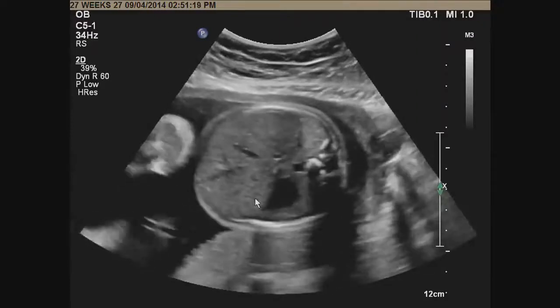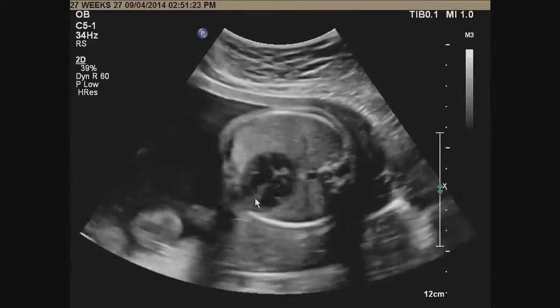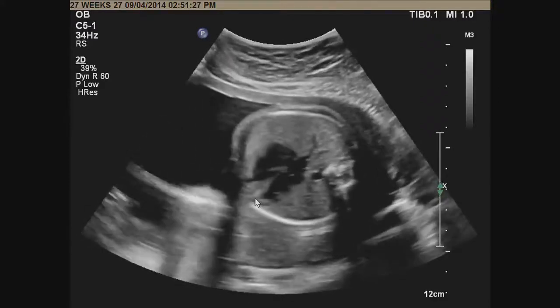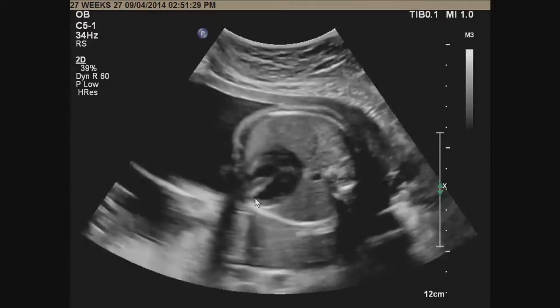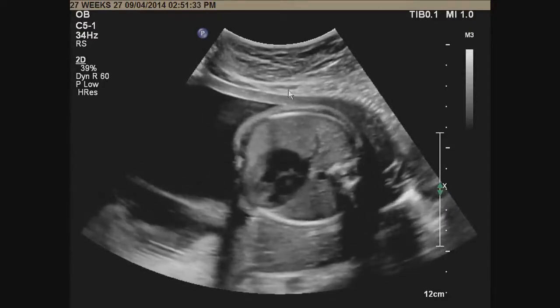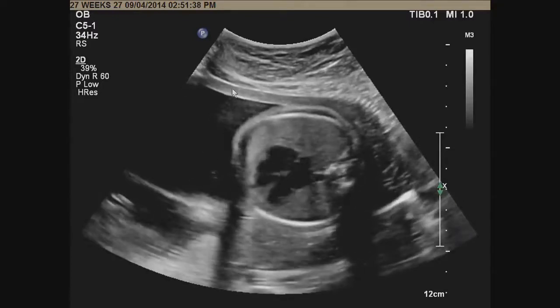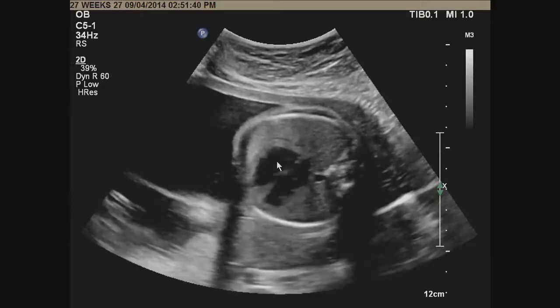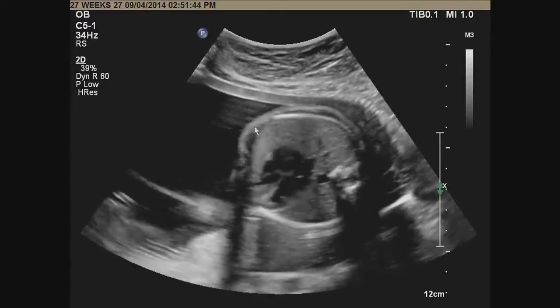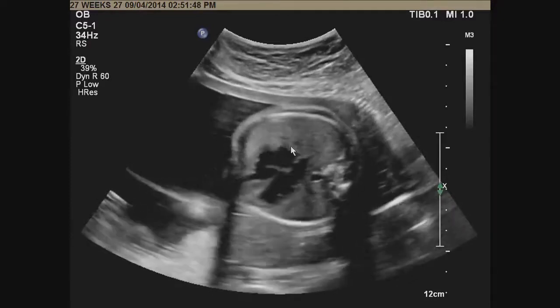Then I'm going to slide back up into the chest. Given that the left side is down, I'm going to try to work a little bit to improve my image. I'm going to slide. You see how I'm coming into the heart through the ribs. So I'm going to try to see if I can image the heart with the ultrasound beam coming away from the ribs to minimize shadowing, but also to help me get to an axial view of the heart. This is what we call a basal view, or coming from the base of the heart.